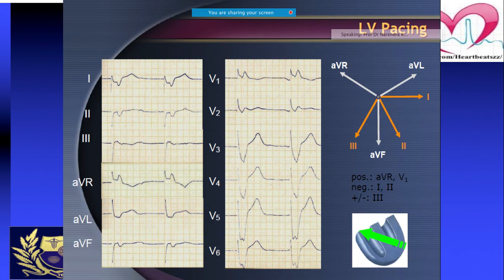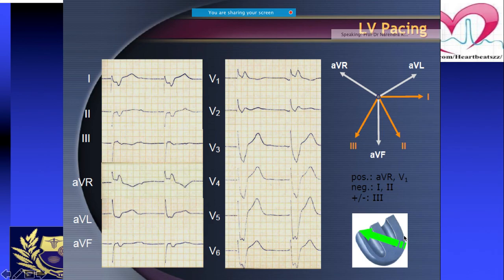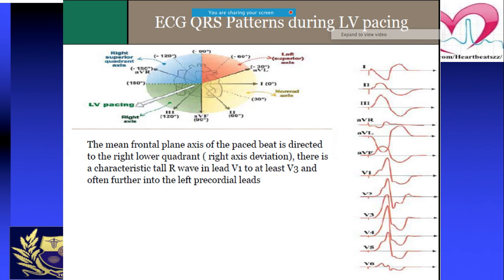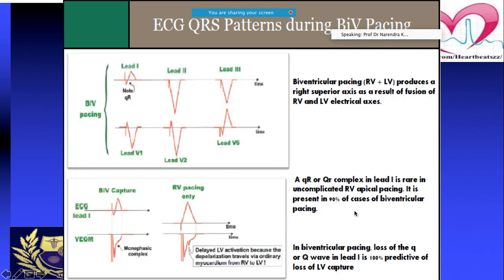During LV pacing, there will be a positive AVR and V1. There will be negative lead 1 and lead 2, and lead 3 can be biphasic. If pacing from the LV, the propagation goes in this direction, so leads 1 and 2 will be negative and AVR will be positive. This is the same pattern as already described for LV pacing.